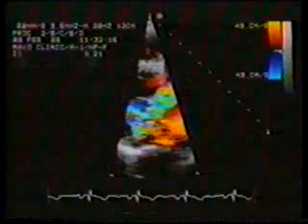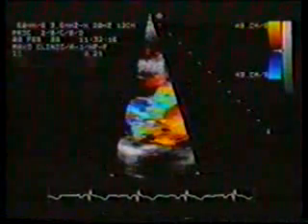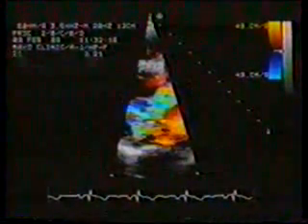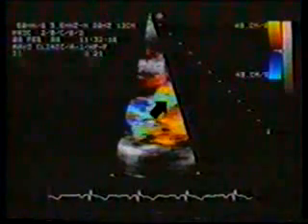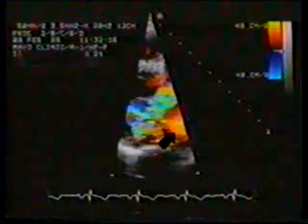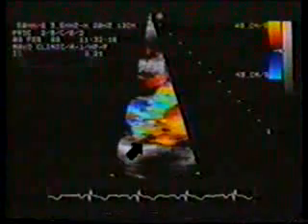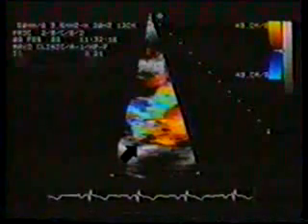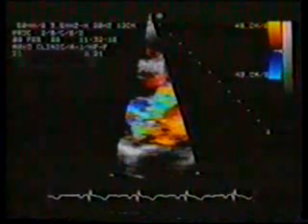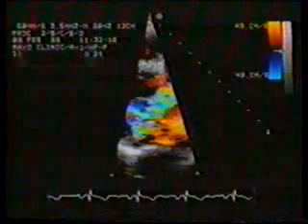With flow imaging activated, the mitral regurgitant jet fills the left atrium. The mosaic portion of the jet has been baffled toward the aorta, and the red portion is from blood that is swirled around the atrium. These jets that are baffled and that swirl within the left atrium are very difficult to trace by planimetry. We believe their severity is best assessed by the visual impression of the spatial extent of the jet.